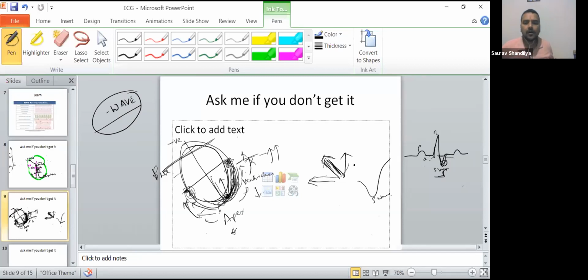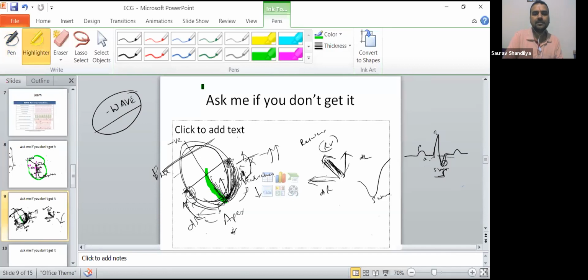Already it has depolarized, but now according to the recording terminal, just see what the vector is. Direction is like this. Say for example, this side L, direction is DL, like this. This side I'll say DR, direction of right is like this. So don't you think in this direction there will be a resultant vector, right? Resultant is like this. Though current was going like this, in one direction, and like this, the resultant will never come like this, right? It will go like this only. Resultant will come like this.